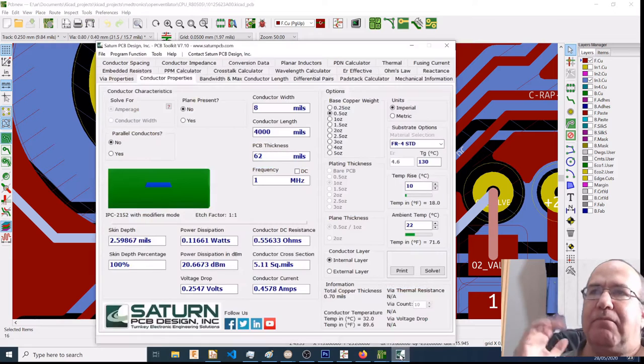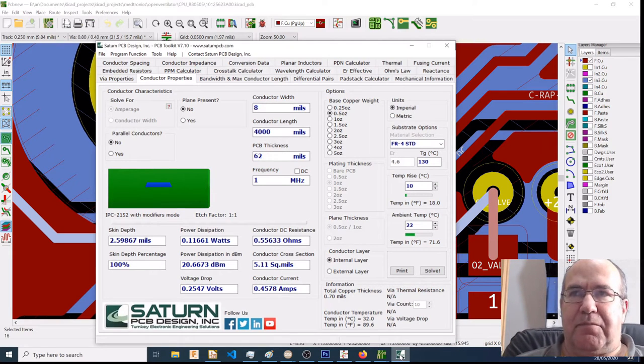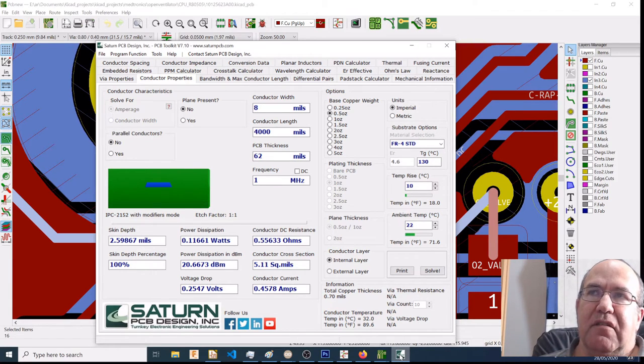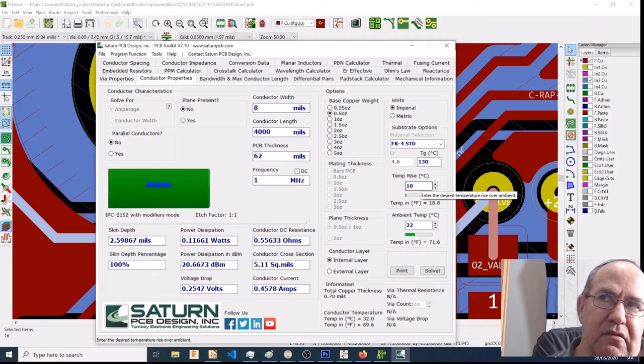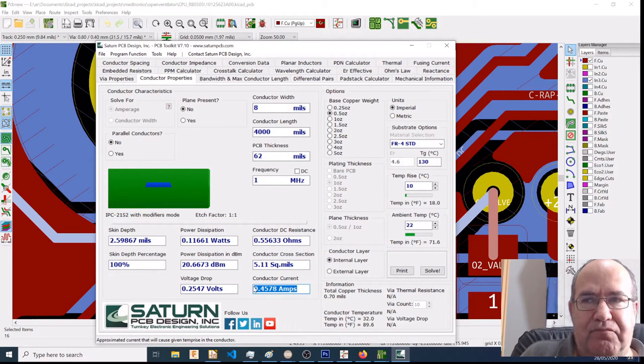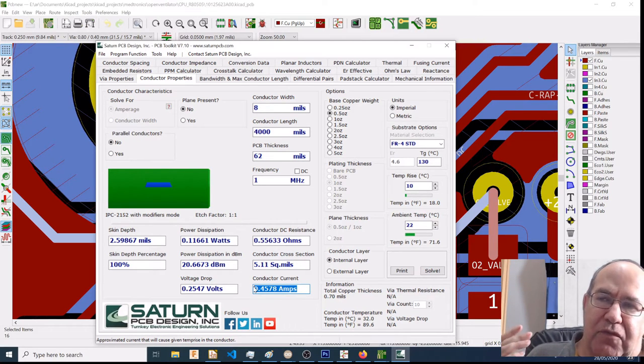Not to waste time, I have open Saturn PCB with a temperature rise of 10 on an 8 mil trace, 4,000 mils is 10 centimeters roughly, is going to have a maximum current of 0.45.